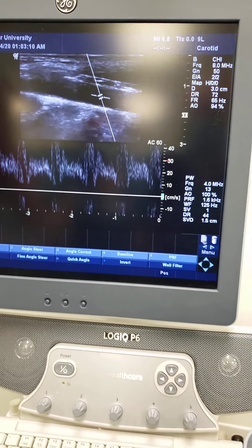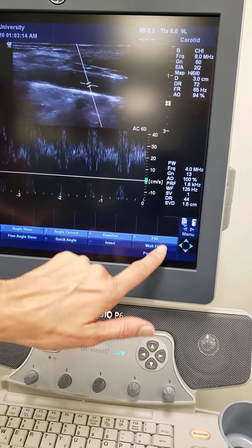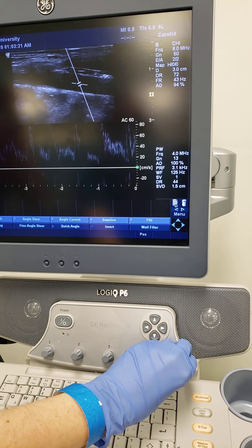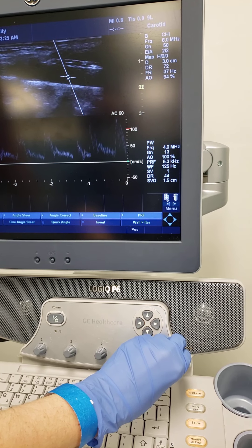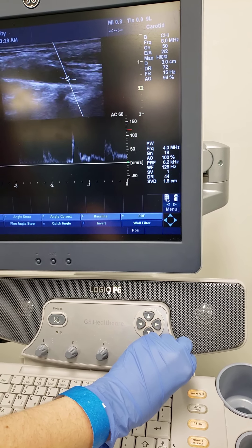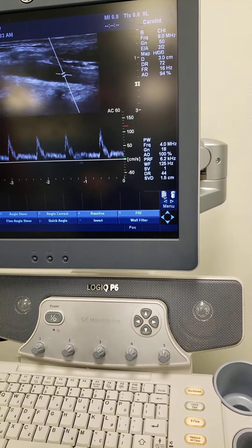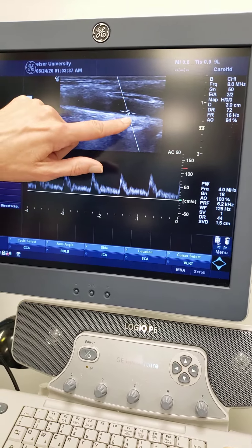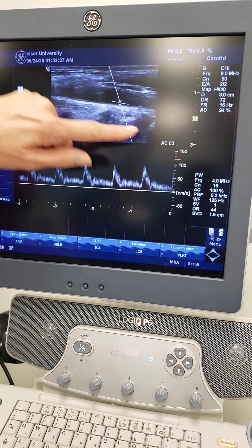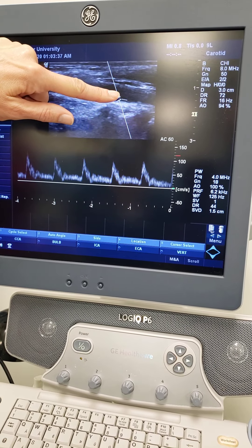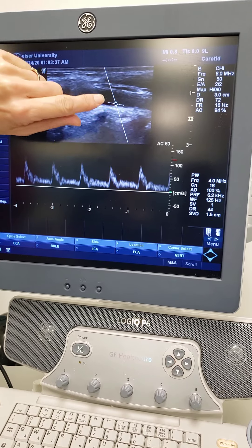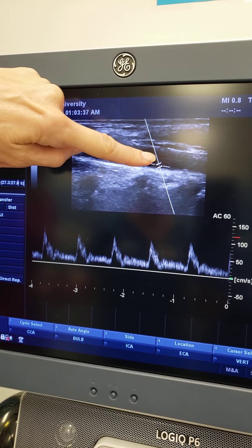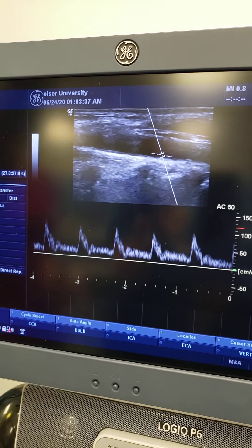Oh, it's aliasing. So how do I fix it? You have to increase your velocity scale. Which is? The PRF. Go ahead and do it. Increase it until you think it's right. We're still aliasing. So you see how we did that? We want this to line up with the wall — that's how you know you're at 60. But you want to bring the gate in where the flow is in the middle, because if you're too close to the edge, you're going to get slow flow. You're only getting what's going through that gate. If I put the gate up here, I'm listening to flow along the wall; if I put it in the center, I'm listening to flow in the center. So line it up with the wall first, and then move it.